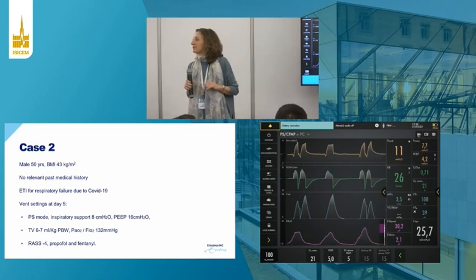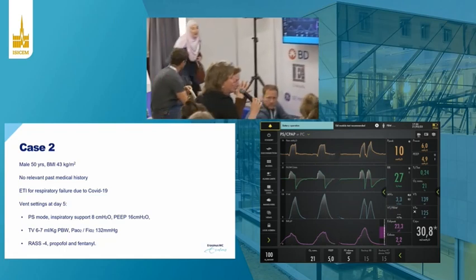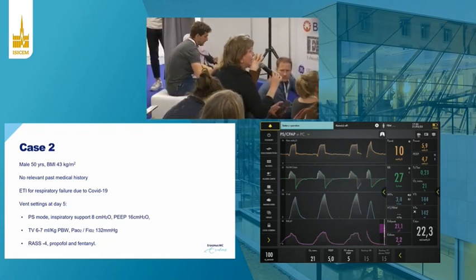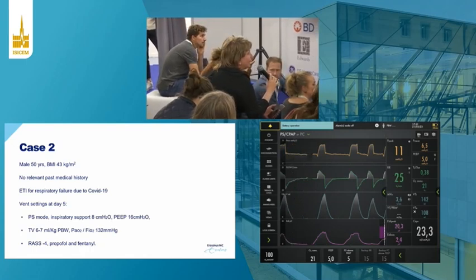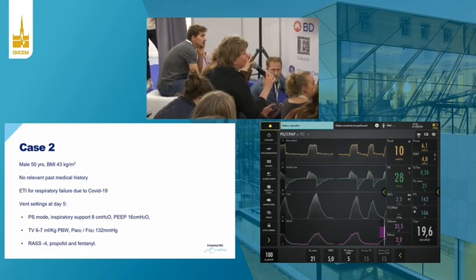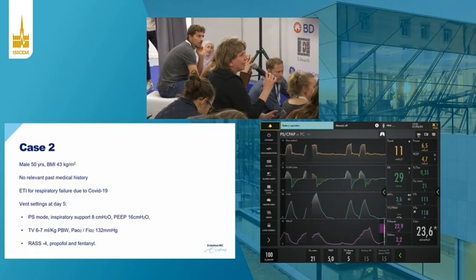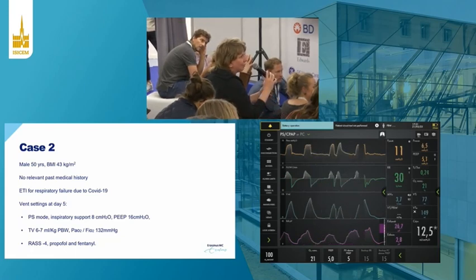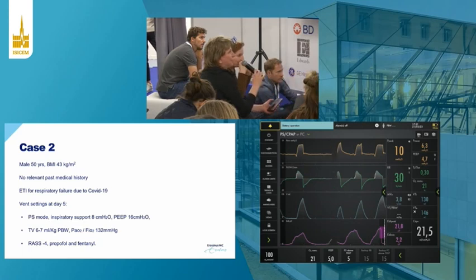Okay, please, one question. Do you think IntelliSync in the ETS or cycle off time is a solution for that? We use the Hamilton ASV, and it has an IntelliSync on the ETS time, so it adjusts itself. I don't have experience with the Hamilton, to be honest. Okay. Then we have to look at it.